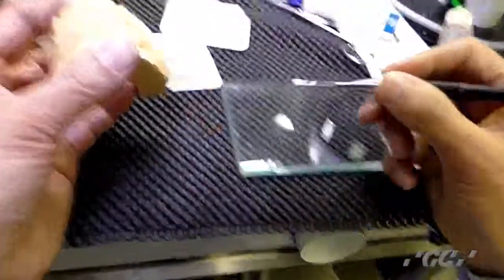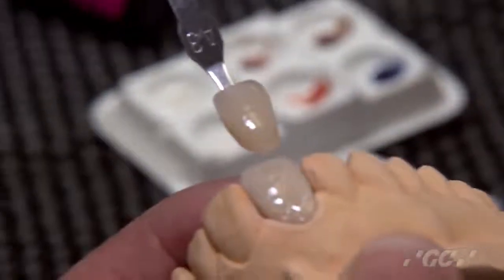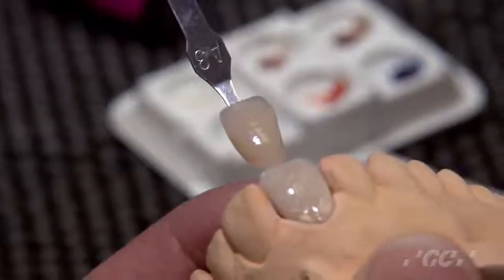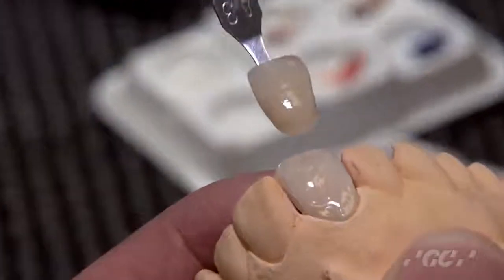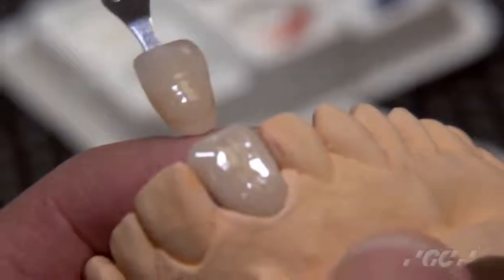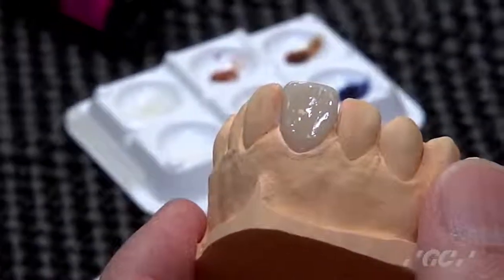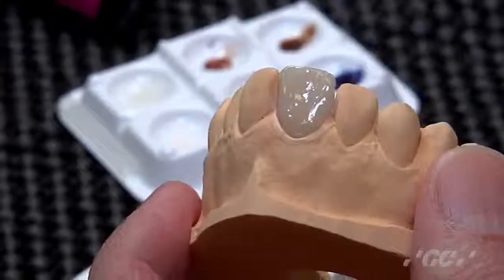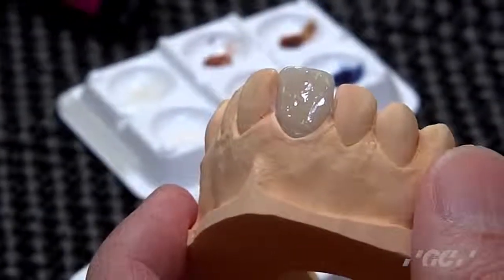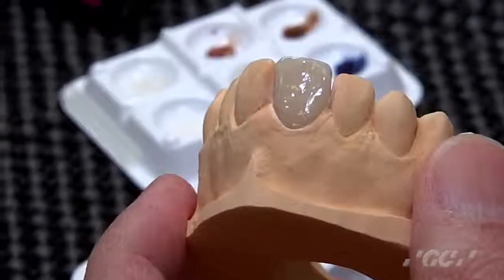Creating a final shade and shape with enamel E1 lighter. You can see some color internally after applying the enamel E1 lighter.